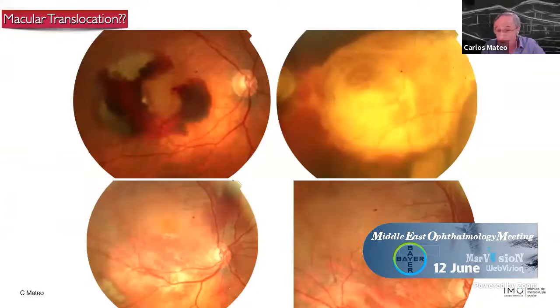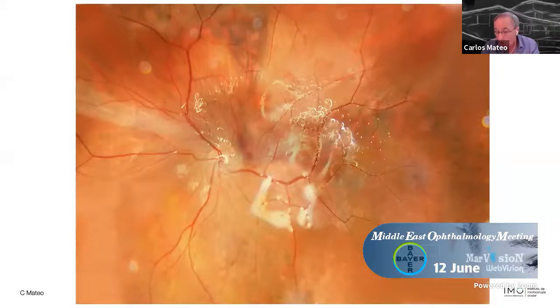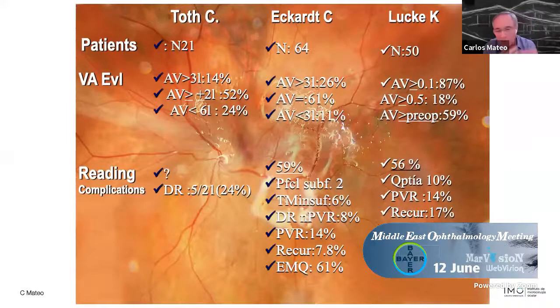We changed, and then we did macular translocation at that time, with 360 degrees retinotomies, and some of these patients achieved a good visual acuity, 0.2, 0.3 vision, increasing reading ability. But the complications in macular translocation made it not so simple to perform. You have retinal detachments, PVR recurrence, macrocystic macular edema, and atrophy.